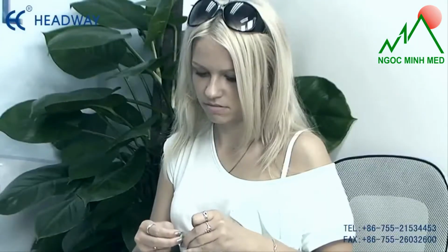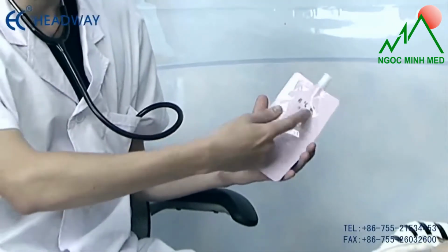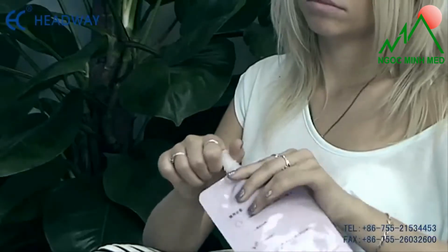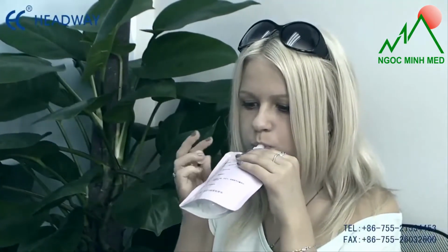4. Take an oral 13C urea capsule with 80 to 100 milliliters of drinking water, and then sit quietly for 30 minutes. 5. Collecting the post-dose breath sample. Follow point 3 to collect your post-dose breath sample 30 minutes after taking the 13C urea capsule and mark it.